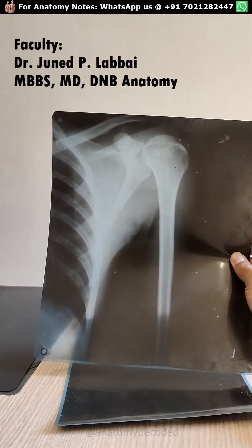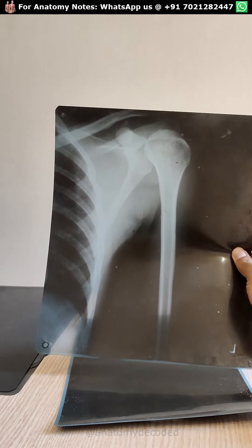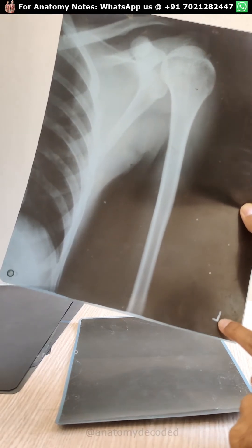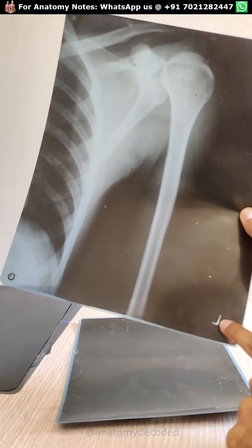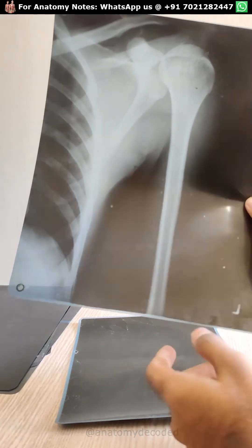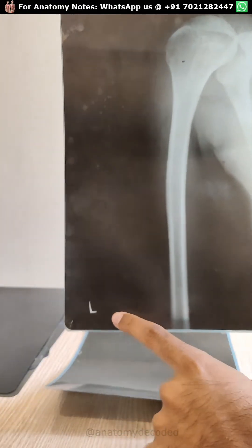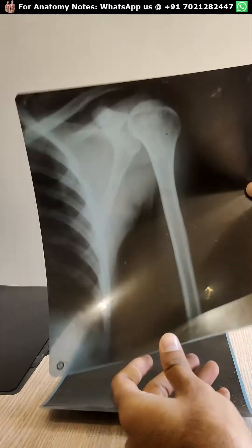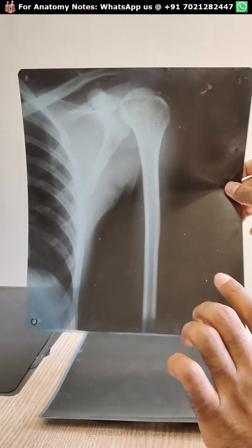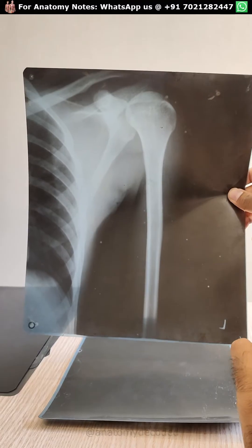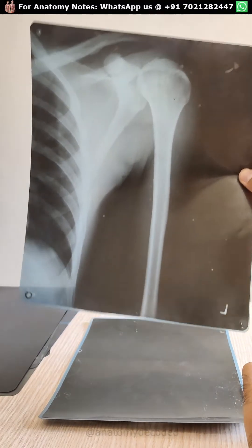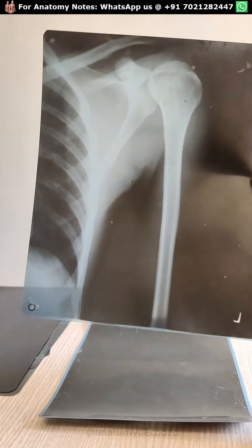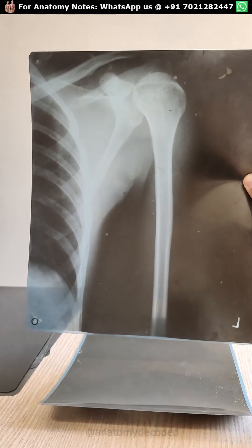This is an x-ray of the left shoulder region. We can identify it is left because most x-rays of sides have markings on them — we can see 'L' here. We have to mount the x-ray so that we are looking at the patient, meaning the patient is standing in front of us. This is a skiagram, also referred to as a radiograph. X-rays were the rays used to produce this film, but the correct name of this film is skiagram.